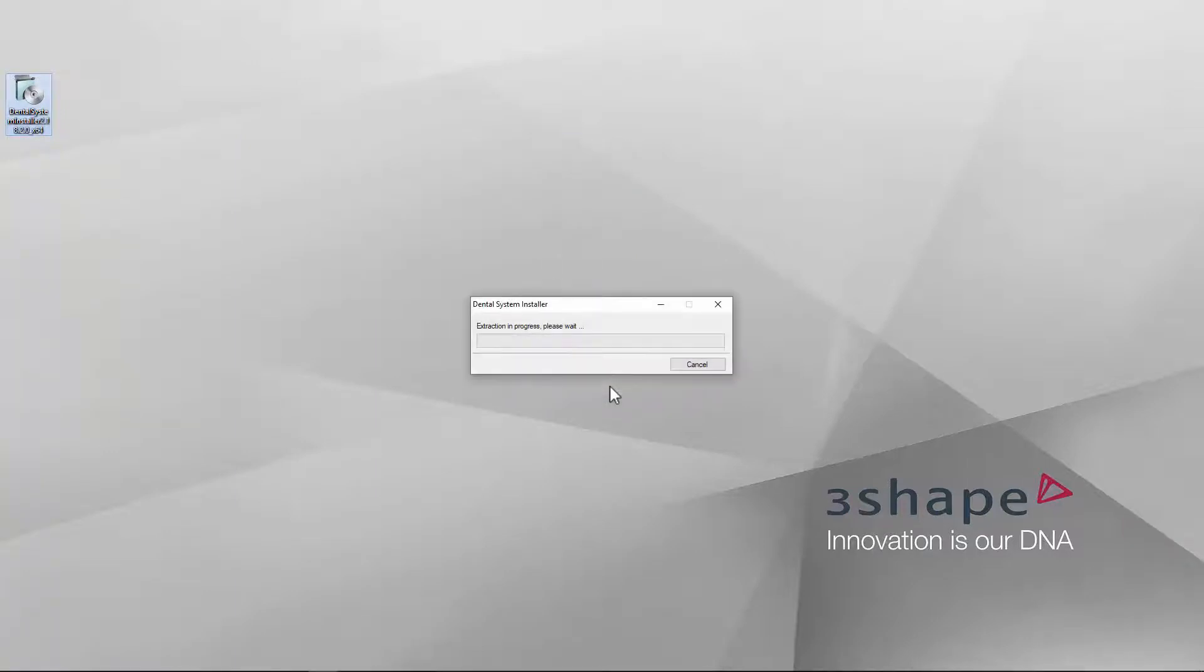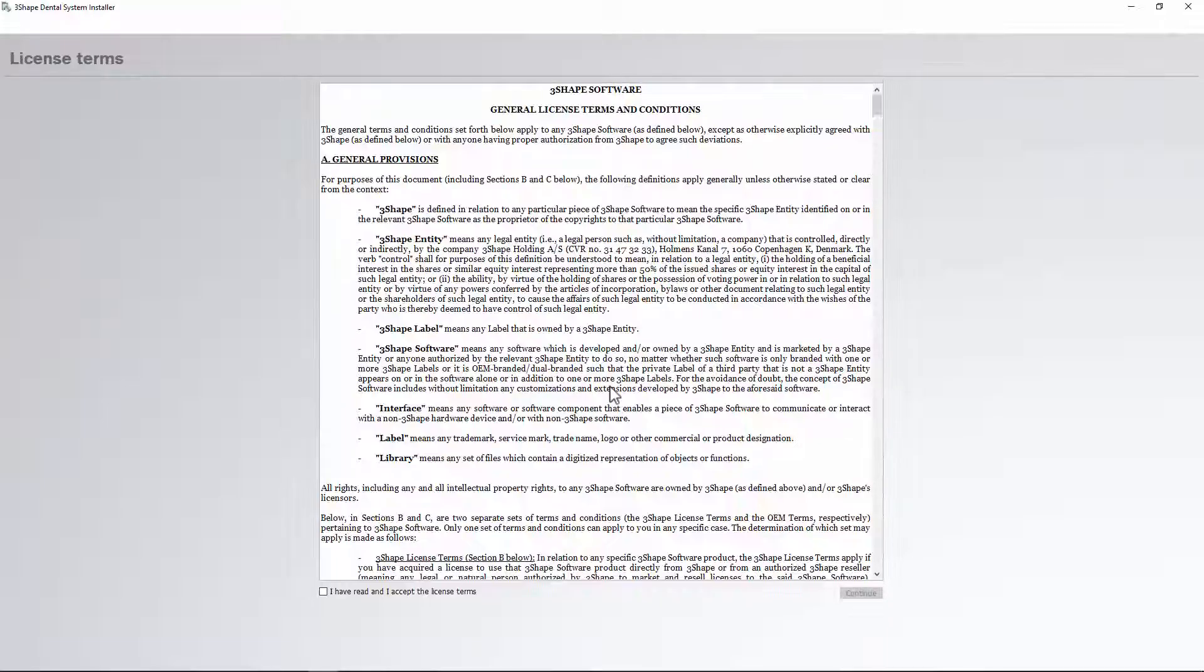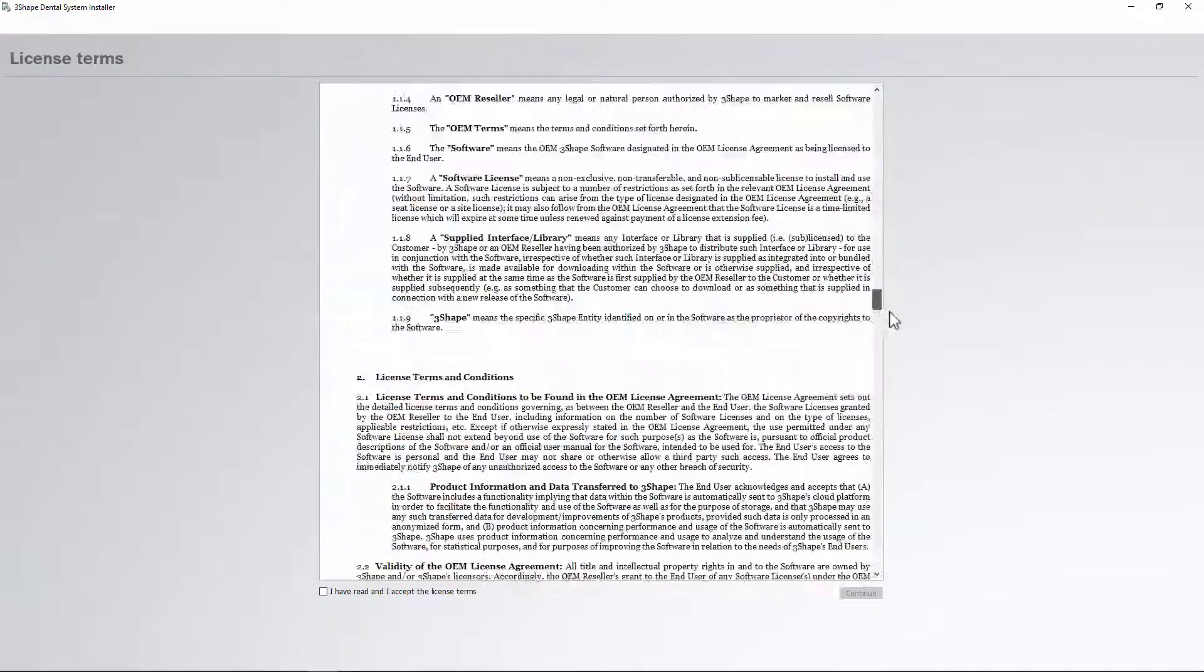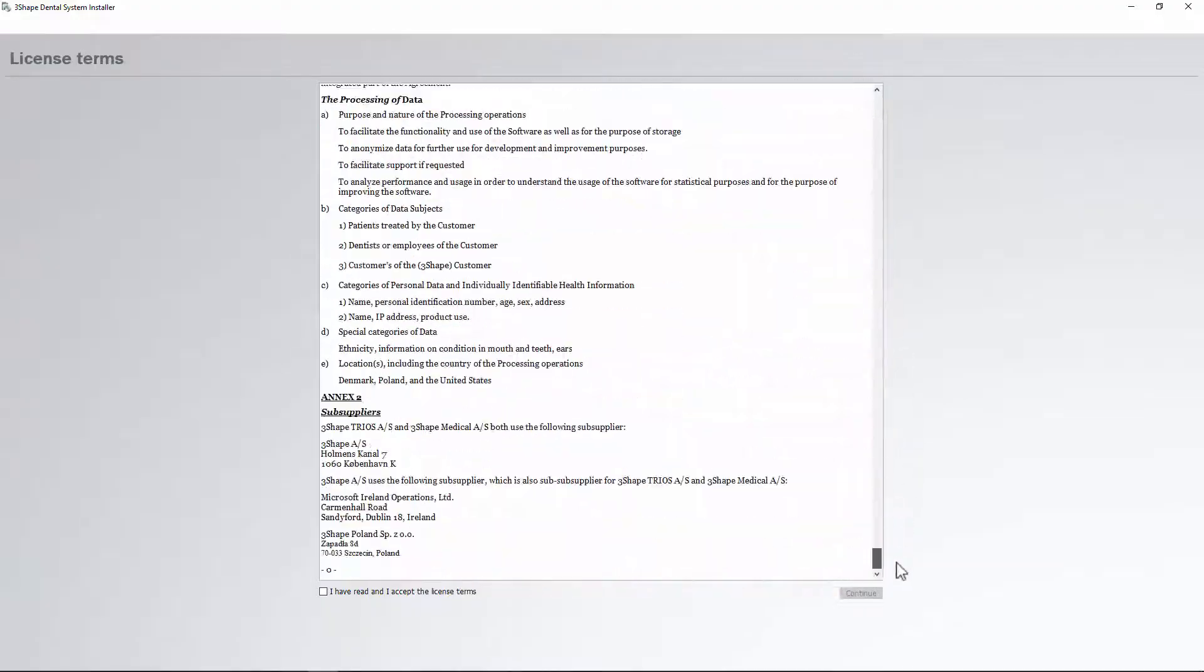The 3Shape software General License Terms and Conditions will open. Make sure that the user reads it carefully and understands. Then scroll down and accept the terms and conditions.